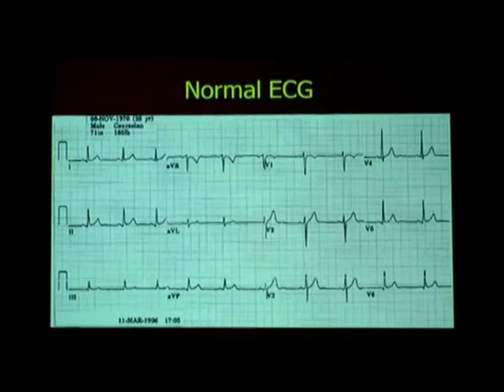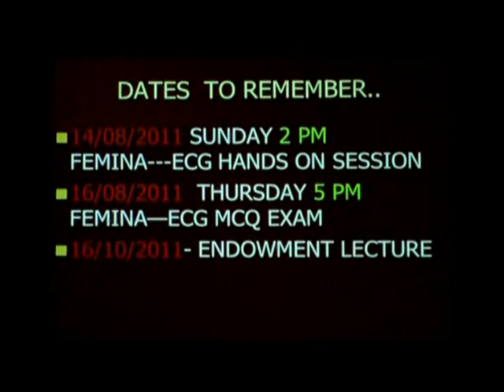Believe in yourself, your clinical knowledge, your clinical acumen, and admit the patient and take serial ECGs. After 10 or 15 minutes you may have a classical acute coronary syndrome ECG, although the first ECG may be normal. So when you know so many advantages of a particular investigation, you must always be aware of its limitations. Then only will you correctly interpret the findings of the ECG.